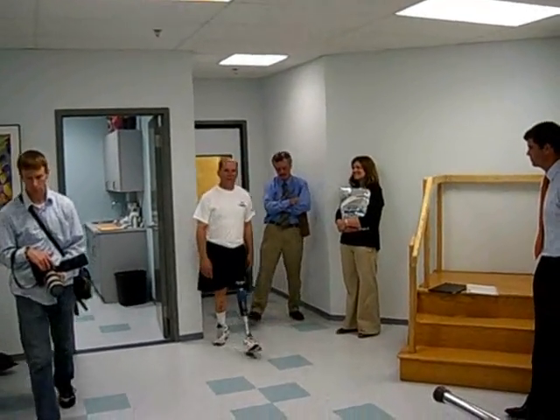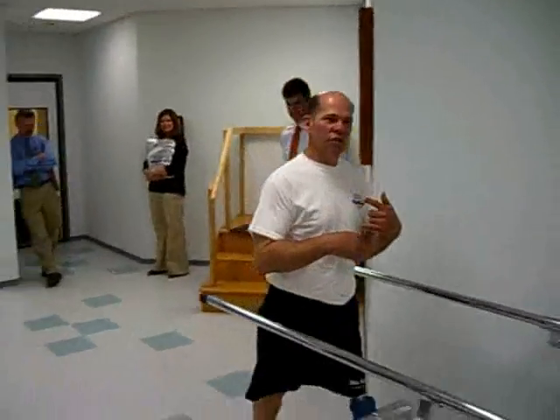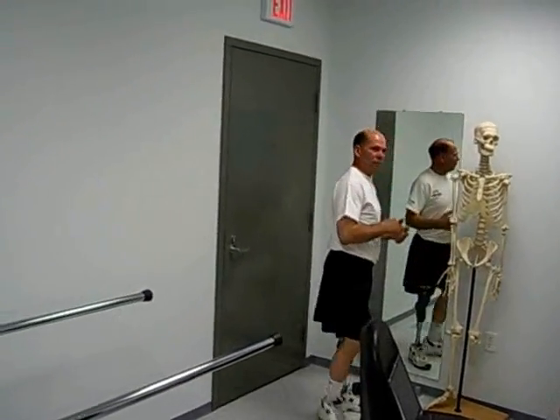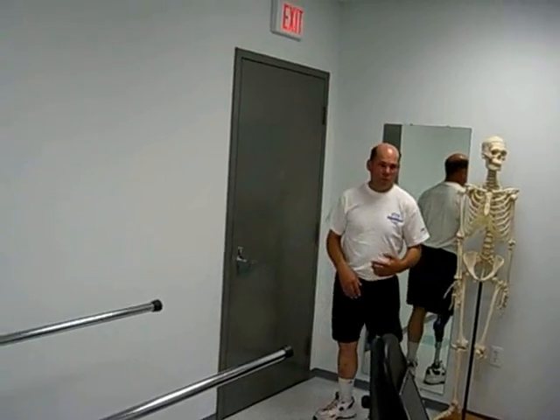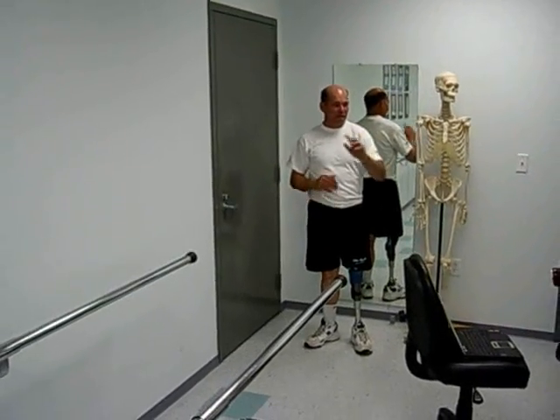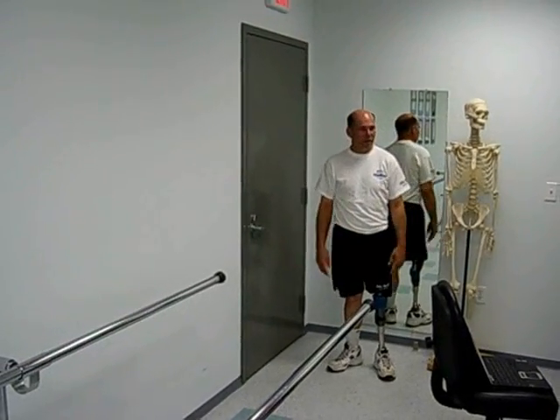I wouldn't be able to stop on my toe — I'd just keep on walking over. That's right, because once the toe contact would hit, your knee would buckle. My knee would just... Now you can ride it. Like when I was demonstrating that — once I released the knee, that was it. That was on the ground.